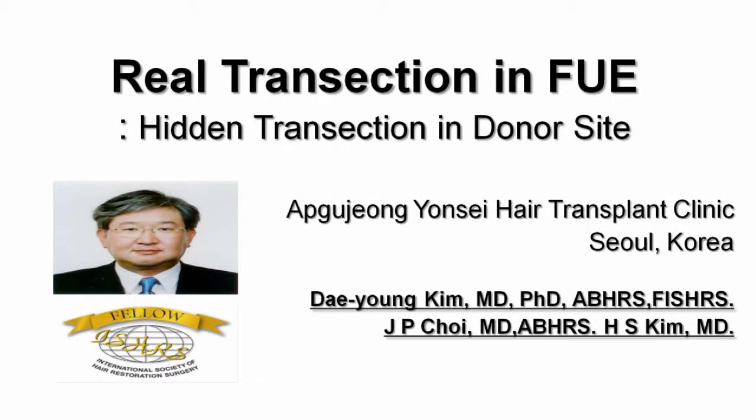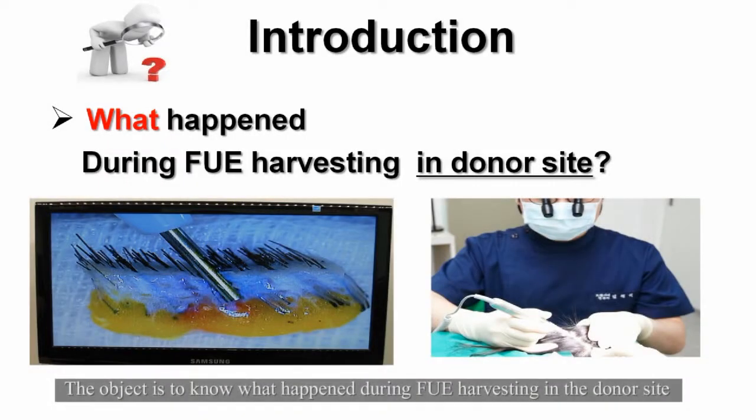Real Transection in FUE, Hidden Transection in Donor Site by Dr. Dae-Young Kim. The object is to know what happened during FUE harvesting in the donor site.